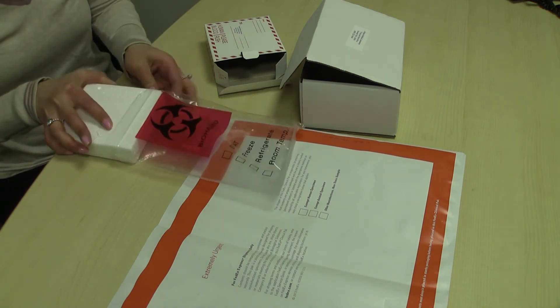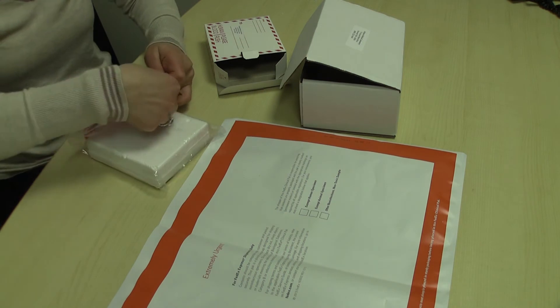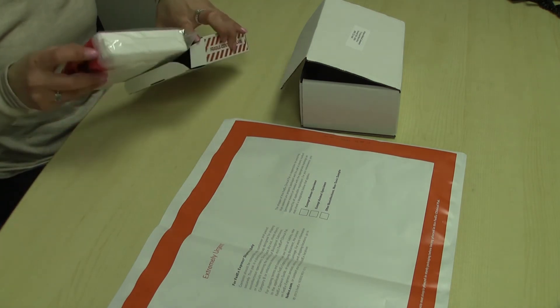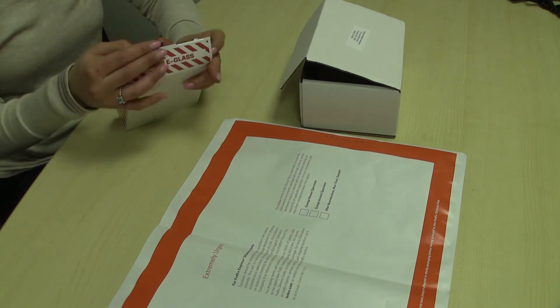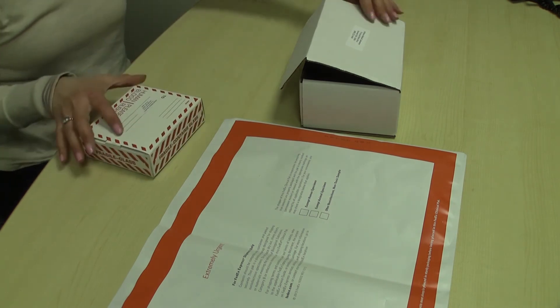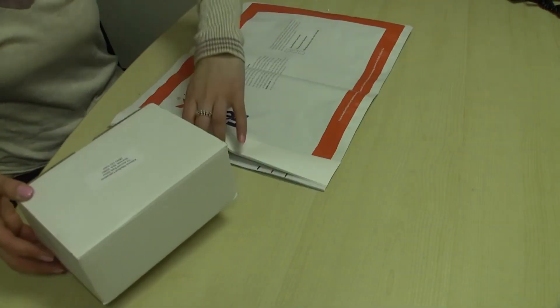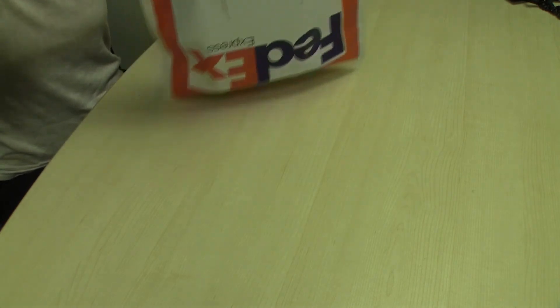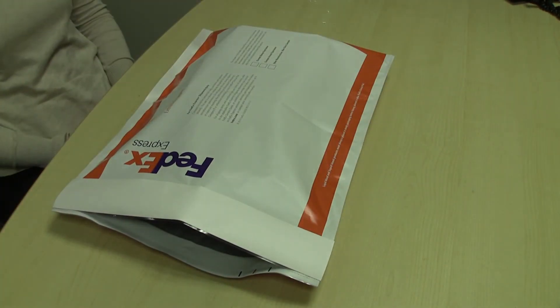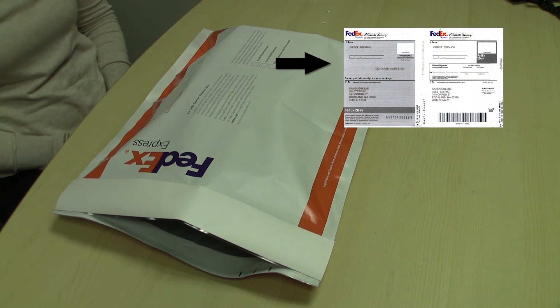Place the styrofoam box containing the blood sample into the biohazardous bag and then into the red and white human blood box. The test requisition and the red and white box should then be placed into the white collection test kit box. This test kit is now ready to be placed in the Express Lab Pack envelope. Seal the bag and adhere the prepaid billable stamp to the outside of the lab pack envelope.